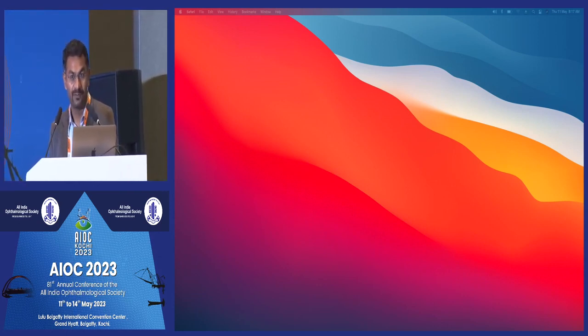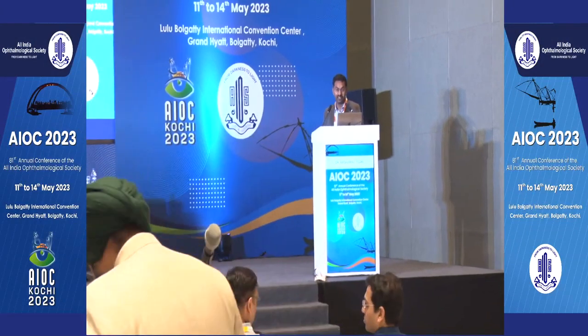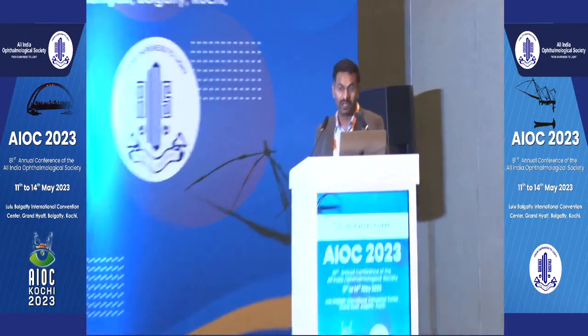Is there any distance from the fovea that you would recommend to do this? At least 1 disc diameter away from the fovea in all directions. Wherever you want, you can do it, but you have to alter the head position.